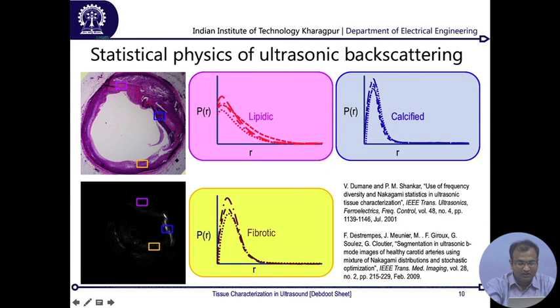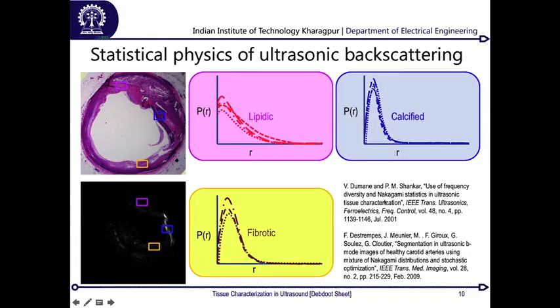There were a lot of papers in earlier days which also made use of these kinds of properties in order to discriminate, but under the assumption that you needed to manually delineate a mass of tissue and then work it out, because whenever you do parameter estimation within an estimator framework, you need to know which samples to take. That would mandate a cohort group of samples which are similar to each other. Although they were doing it manually, our task over here is to make it a totally automated process where you get signals and you just analyze them.